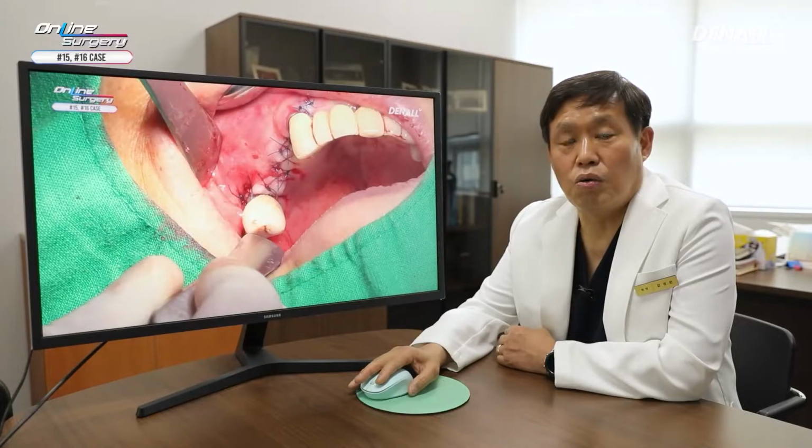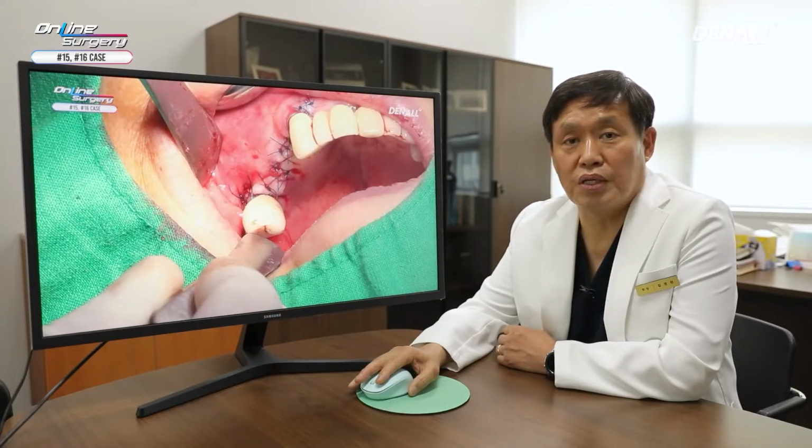LAS KIT was used. The lateral window, the bony lid was used, not in the original position, but on the buccal side of number 16 where there was a buccal defect. Xenograft AOS was also used. I used the bony lid like an autogenous bone graft. Collagen membrane was applied to do GBR, and that's how the surgery was closed, as mentioned.